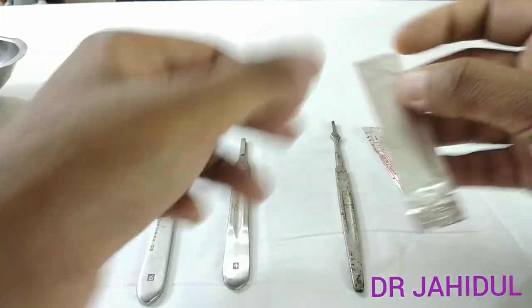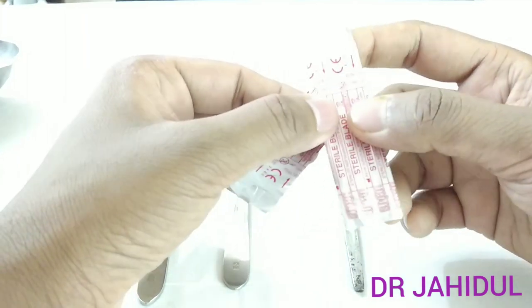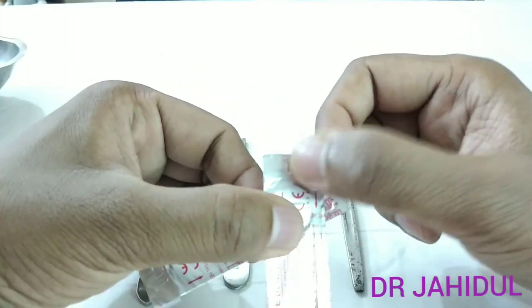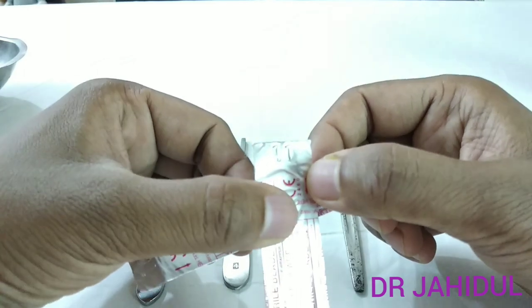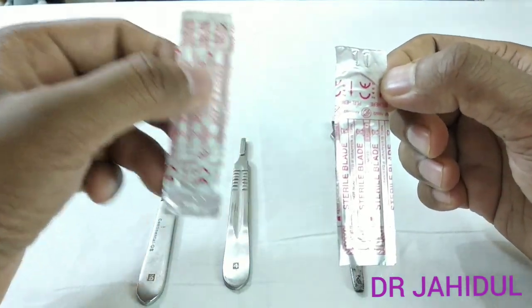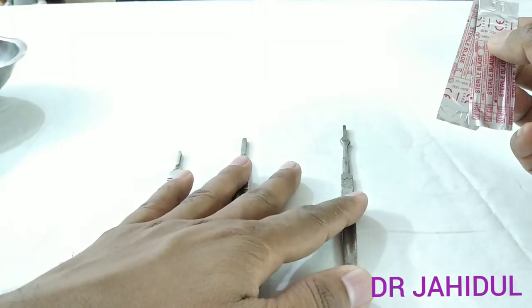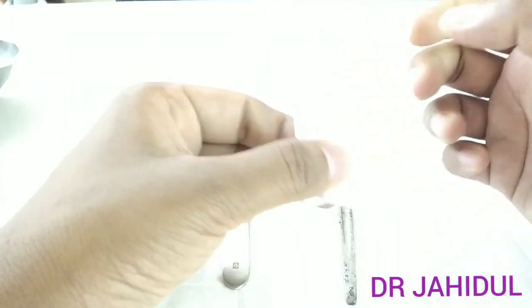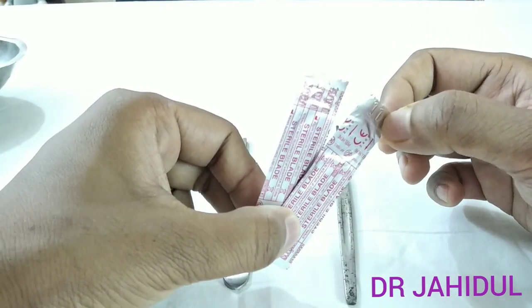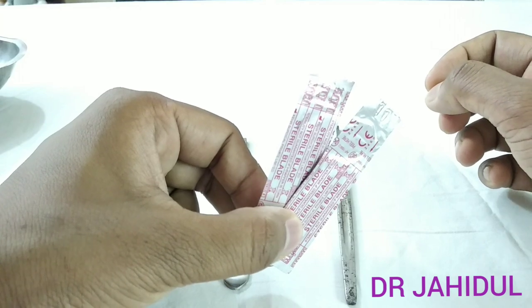The surgical blade may also be different in size, written over its foil — like this is number 11, and also written over the blade itself. The BP handle is sterilized by autoclaving, and the BP blade or surgical blade is pre-sterilized and packed in industry by gamma radiation.